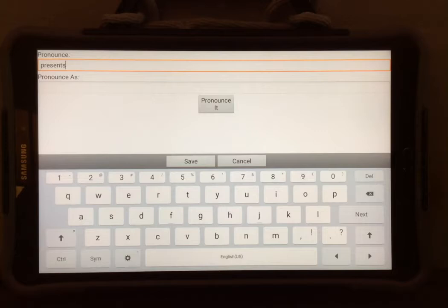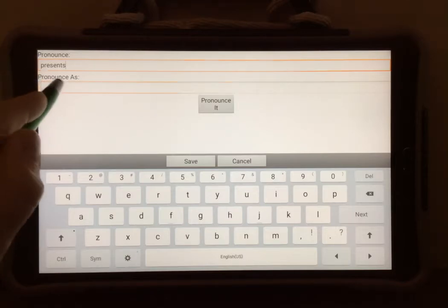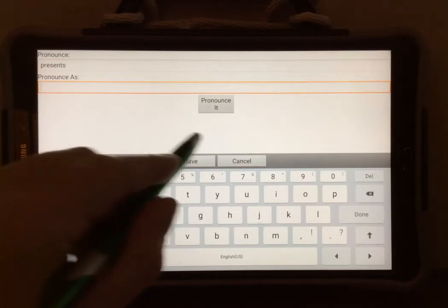Then, where it says pronounce as, tap the box underneath. Now type in the word phonetically.